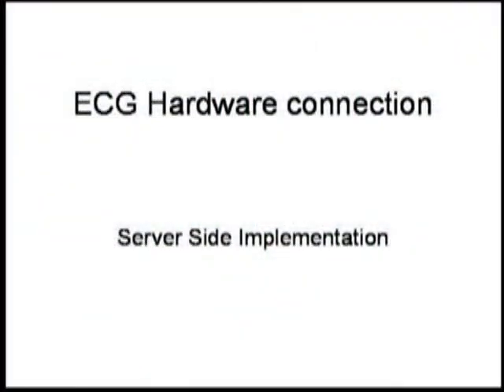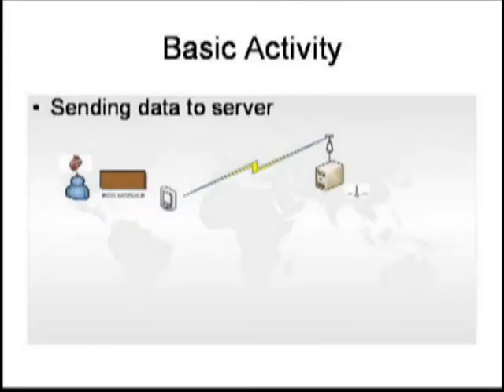We made a hardware connected to the TAUI2 to get ECG signals from the body and send them to the TAUI2 to be changed from analog to digital and sent to our server. It shows the basic activity, getting signals and sending them to the server.